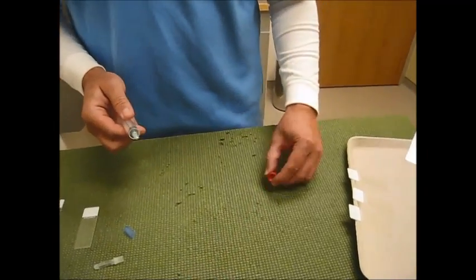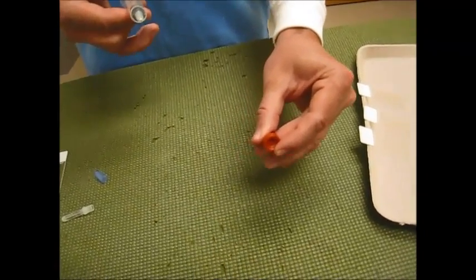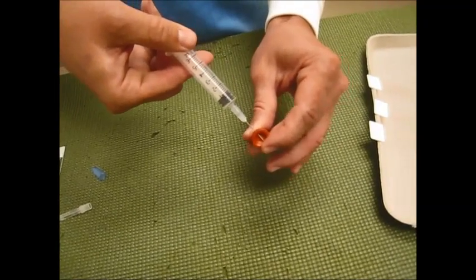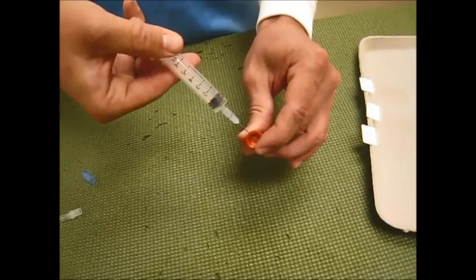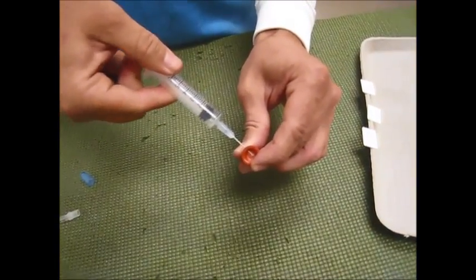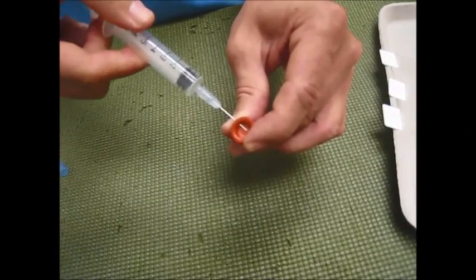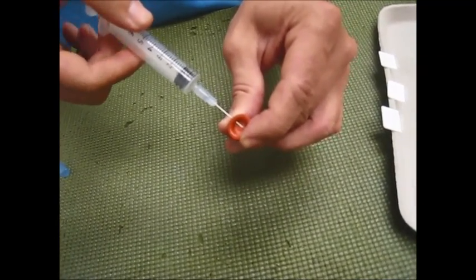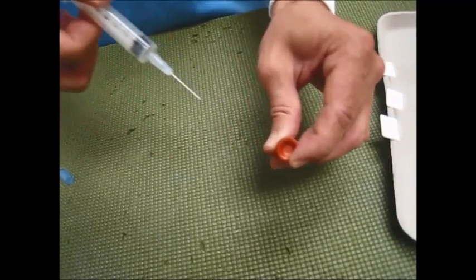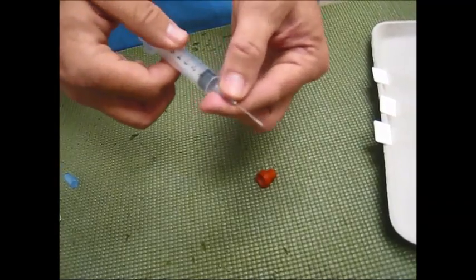You're going to firmly grasp the item to be aspirated, insert the needle once it's in the tissue, then aspirate gently in a pulsatile fashion, probably not going more than 2 cc's of suction.